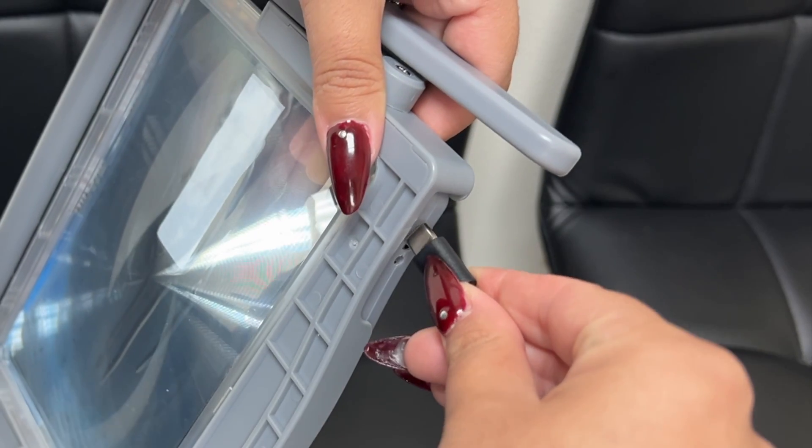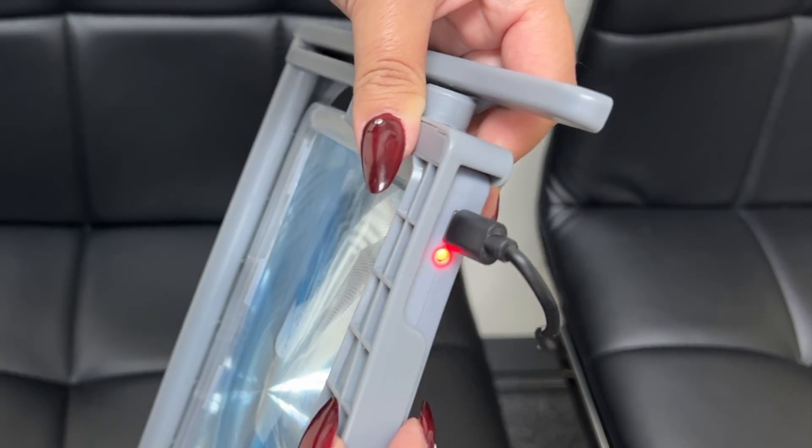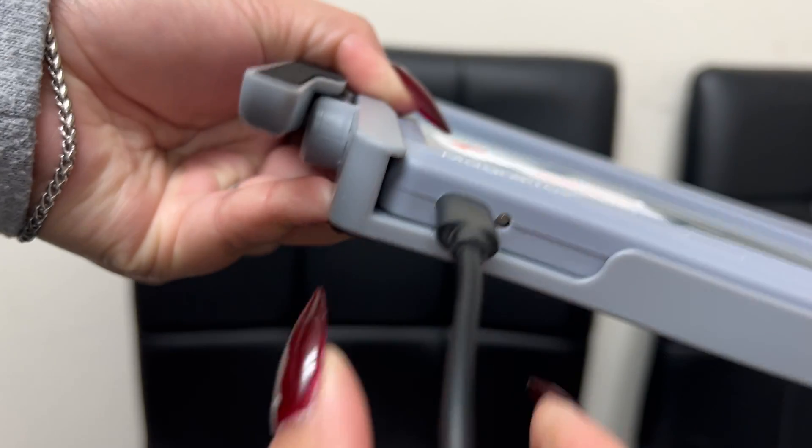The wonderful thing about this magnifier is that it's rechargeable, so the use of batteries can be a thing of the past.